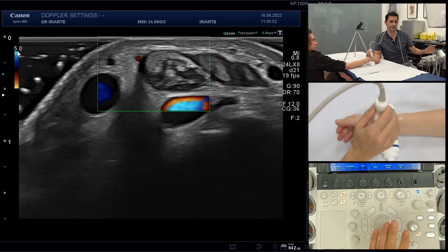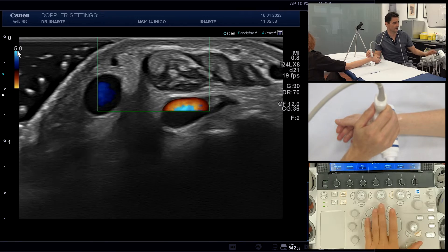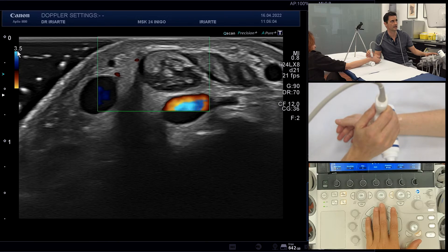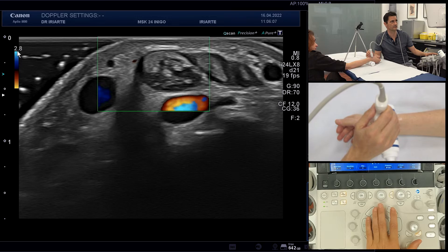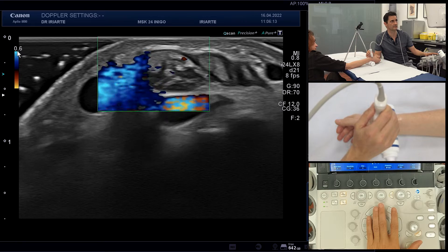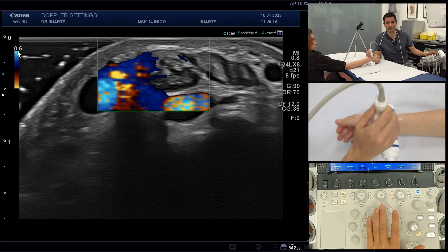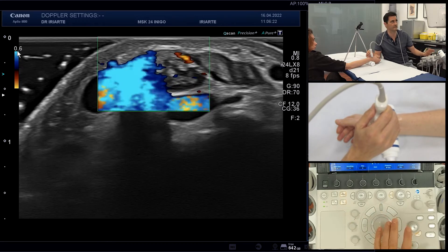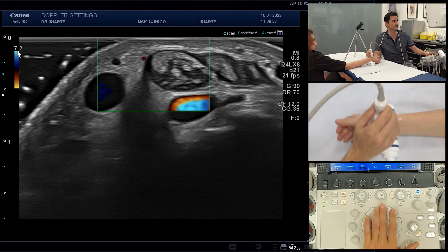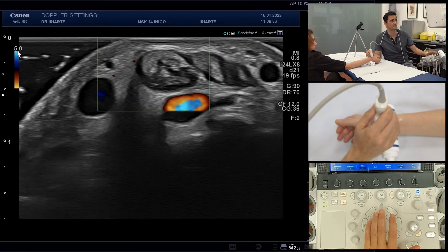The first parameter is the PRF — the pulse repetition frequency that the probe emits. If we decrease the PRF, we will notice how the Doppler signal becomes heavier and even causes artifacts, because the PRF is too low. In musculoskeletal practice, for small vessels, we usually use a PRF of five or six — that may be a good value.